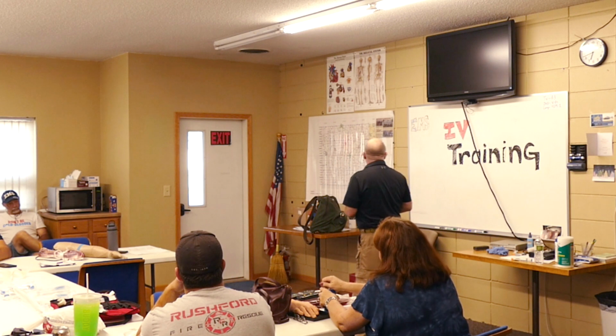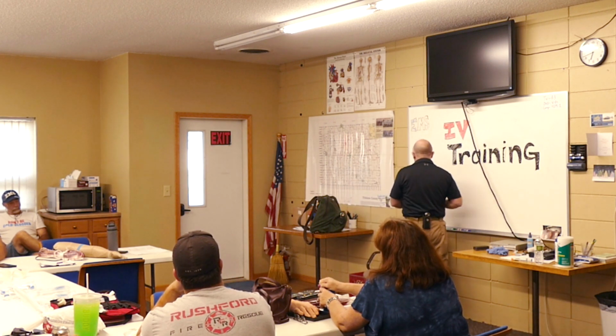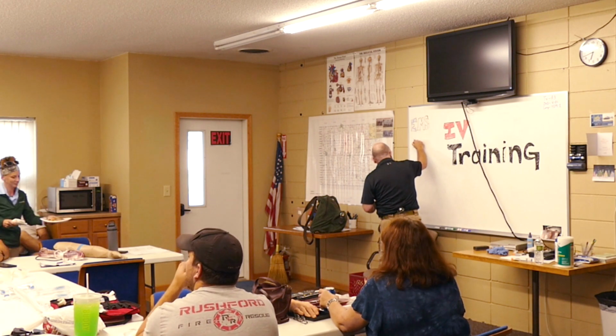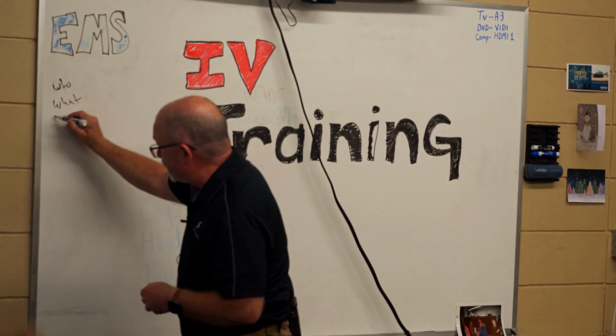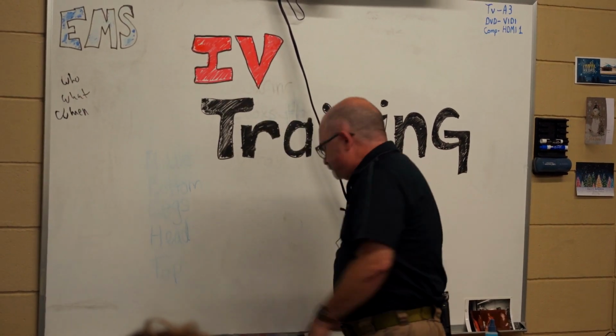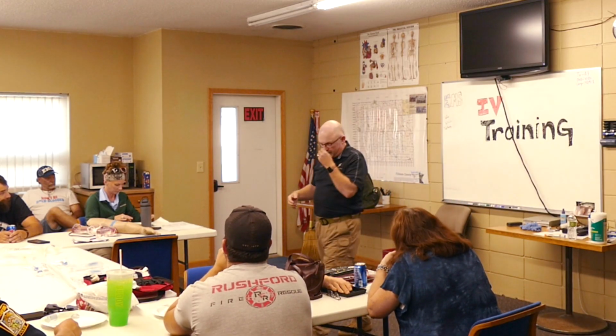What other types of things? Cardiac. Dehydrated drunk people. So I heard cardiac. Yeah, cardiac. Heat injury. So cardiac, why is that important? Why would IV access for a cardiac patient be important?